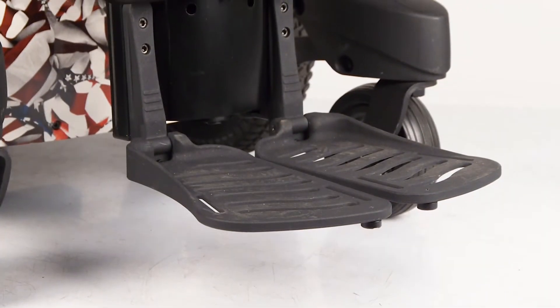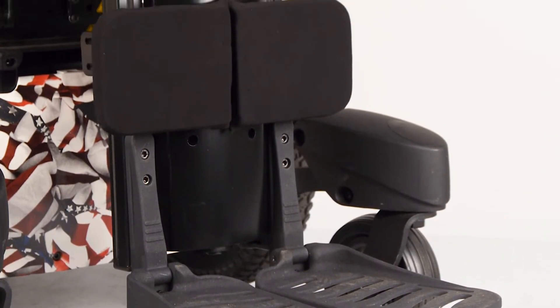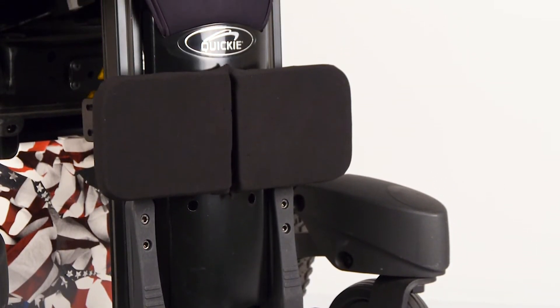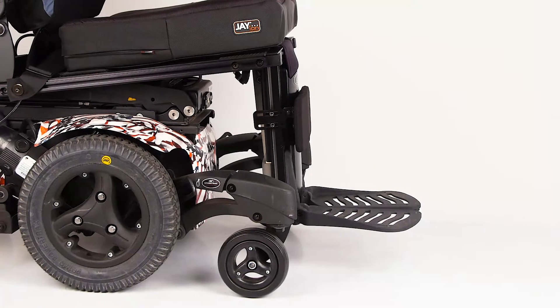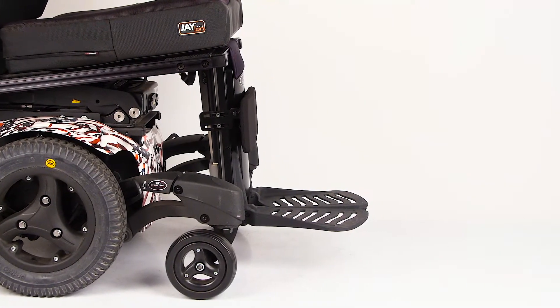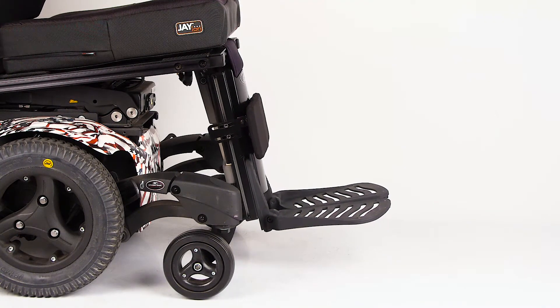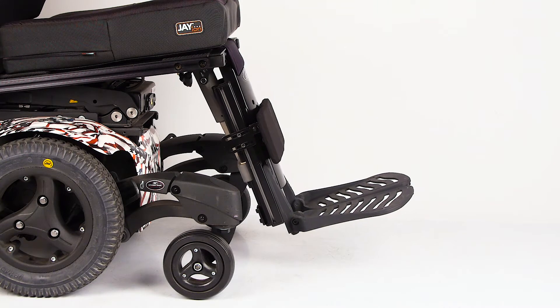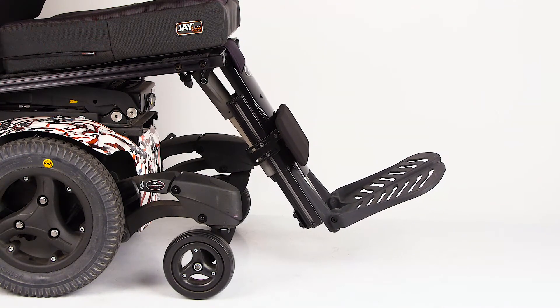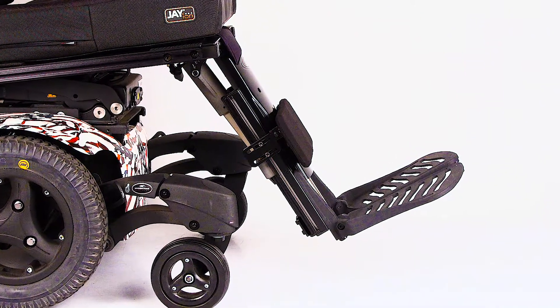Welcome to the Enhanced Quickie Power Center Mount Legrest. Today we'll be examining the benefits of this new Center Mount Power Legrest system. In broad terms, the Quickie Power Center Mount Legrest is like most Power Center Mount Legrests — it elevates with articulation and supports a wide variety of user needs. But there are a few important features that distinguish the Quickie Power Center Mount Legrest.